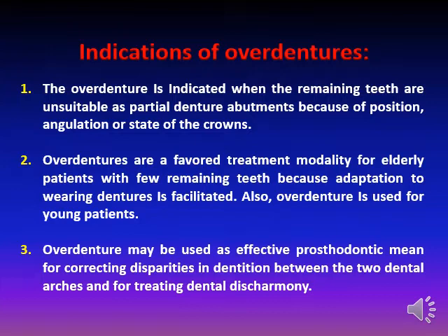Overdenture may be used as an effective prosthodontic means for correcting difficult relationships between the two dental arches and for treating dental disharmony.